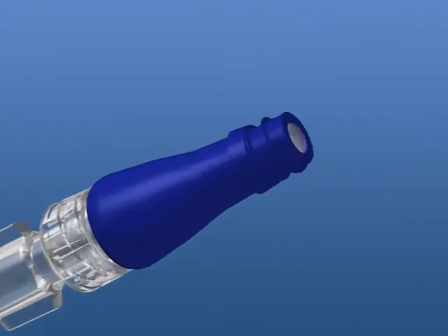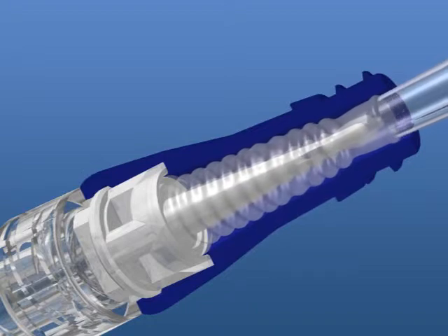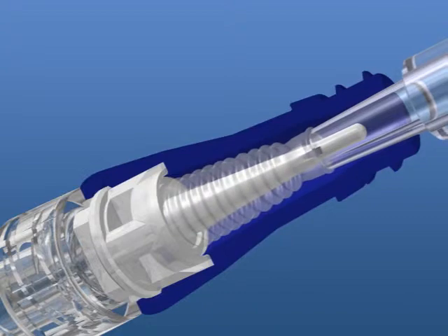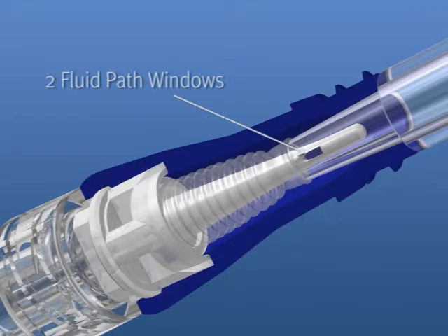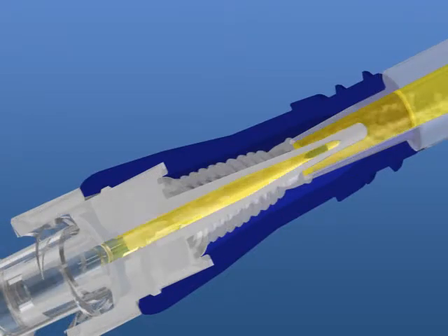As the access luer contacts the sterile silicone surface and begins to compress the septum, a dynamic seal is created and the internal blunt cannula begins to pass through the split septum. Not until the silicone is compressed and the windows of the cannula become exposed in the internal diameter of the access luer is the fluid path accessed. This creates the dedicated internal fluid path, where at no point does the exterior of the access luer, split septum, or housing come in contact with the fluid path.